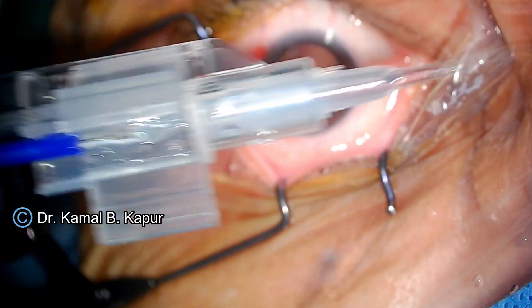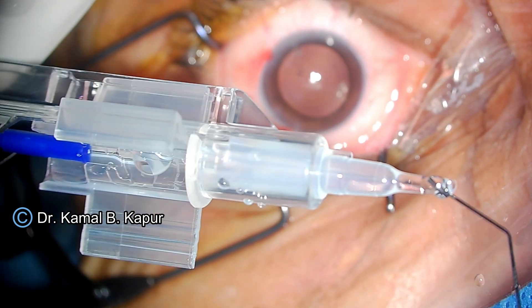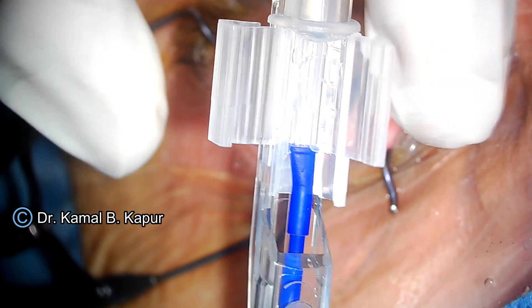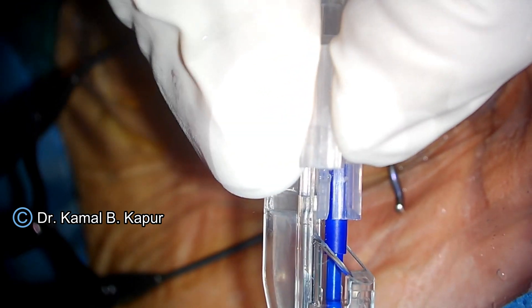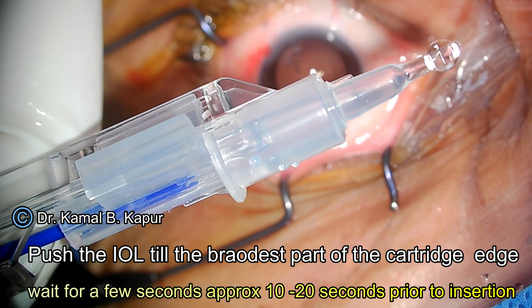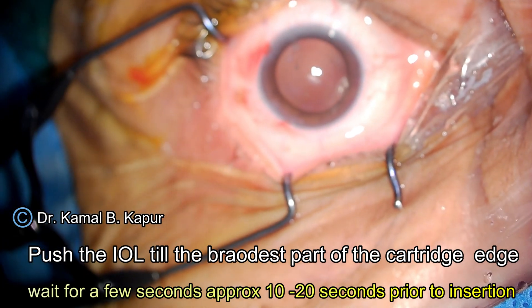What we need to do is instill some BSS just underneath the flap cover so that the lens is wetted from underneath. Then we put some BSS from the other edge of the cartridge, making sure that the BSS flows out from the lower end. We can do the same from the lower end upwards as well.